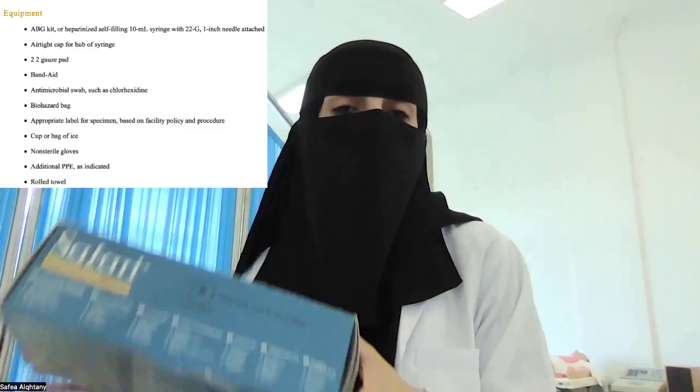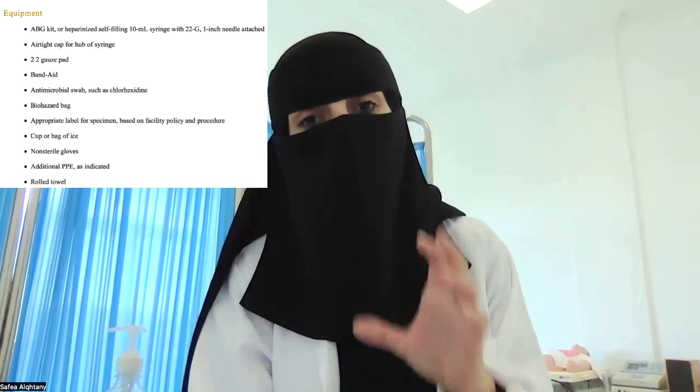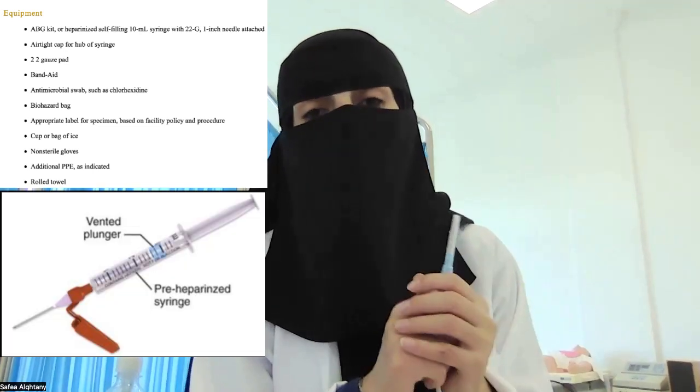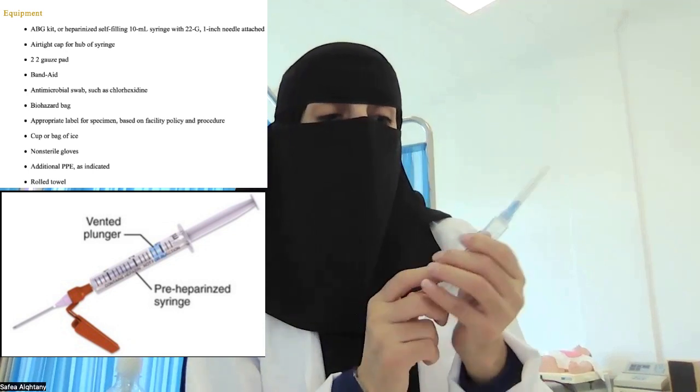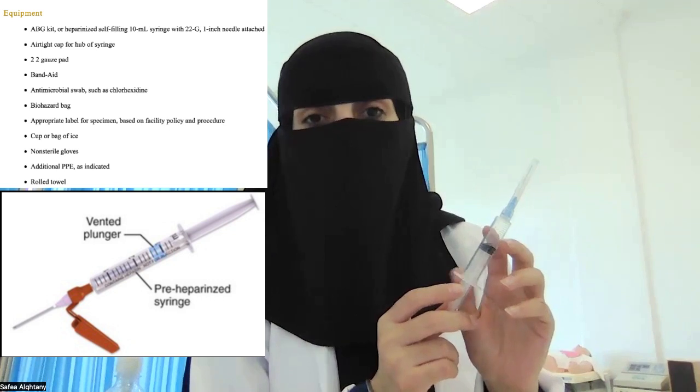Okay, so what are the equipments that we need for this procedure? First, we need non-sterile clean gloves. We will need an ABG kit. طبعا ABG kit يكون موجود جواتها syringe that is self-filling with heparin or heparinized self-filling syringe. يعني السرنجة أساساً تكون فيها هيبارين حتى يمنع تجلط العينة فيما بعد.